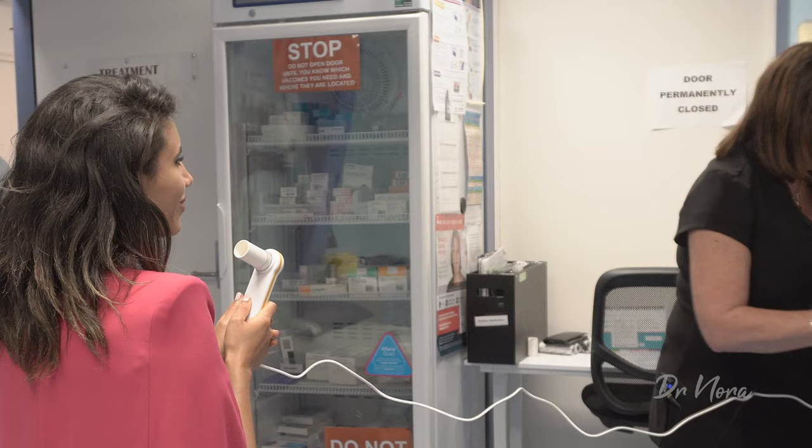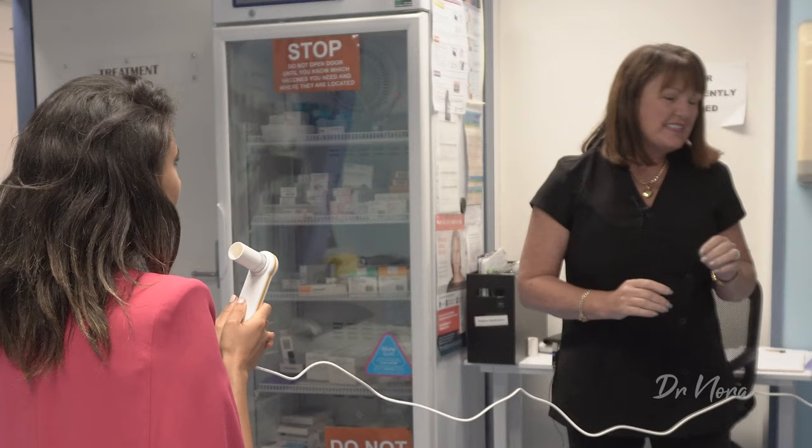function tests. As a general practitioner, many of you will come in, say, with a cough or difficulty breathing or even shortness of breath. And as a doctor, we need to find out what exactly is wrong with your lungs. And so to do this, we use a machine known as a spirometer, and that helps us to diagnose conditions such as pulmonary fibrosis, which is scarring of the lungs, asthma, chronic obstructive pulmonary disease, and even cystic fibrosis. So let's go and get the nurse and see how we do this test.